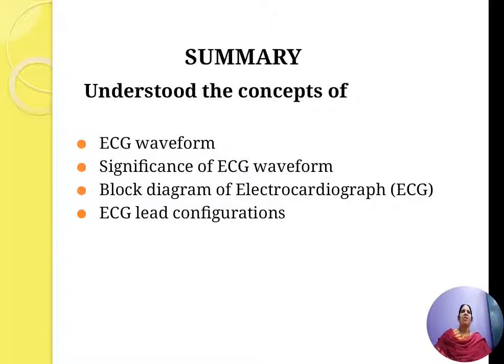The buffer amplifier is connected to the lead to amplify the signal produced from the patient, and it increases the input impedance. The overload voltage protection circuit is necessary to avoid any damage to the bio amplifiers in the recorder when there is voltage fluctuation.